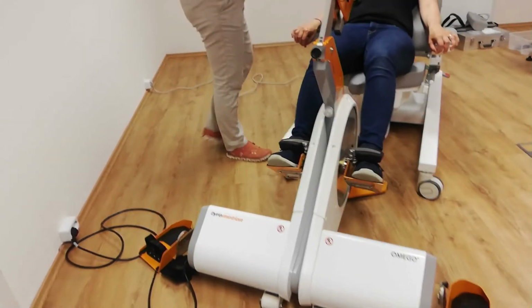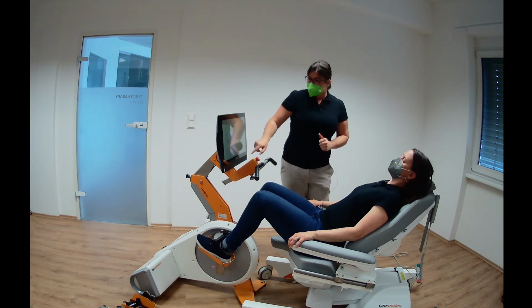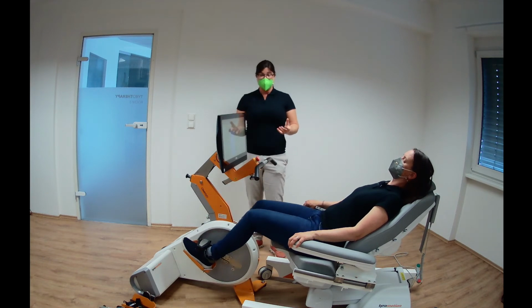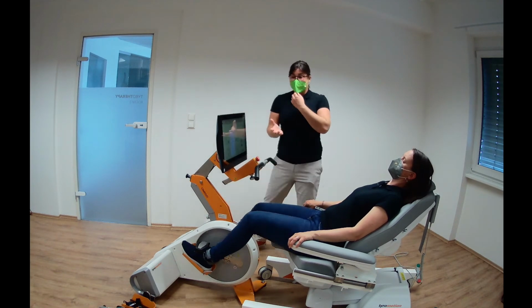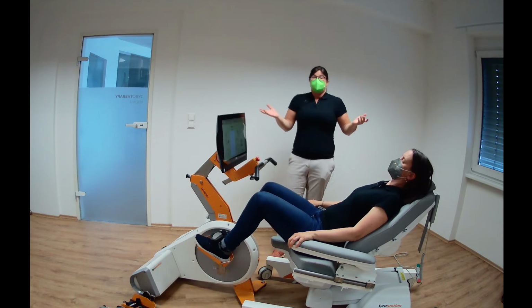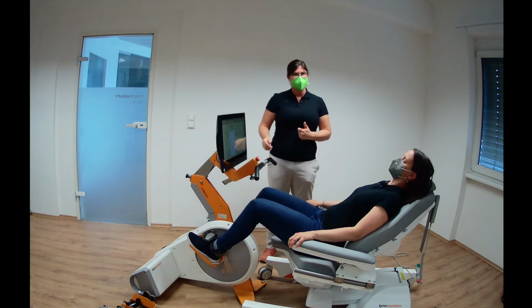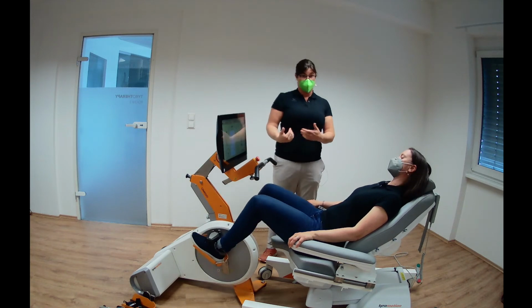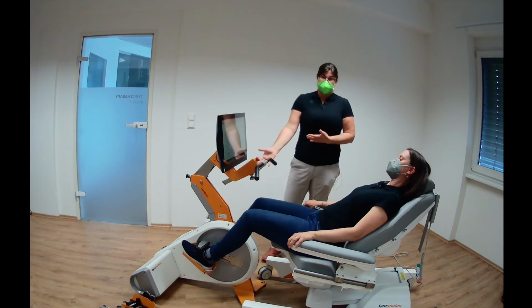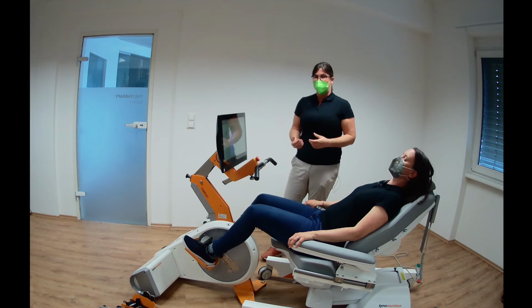All right, thank you very much. So I will make a step back again. Here you can see it again. We are in the coupled mode, so both legs together. If I ask Barbara now to press only one side, the other side will follow. So this is what we know from the gym. We can cheat in the gym a little bit, so we can use the non-affected side more than the other side. Here we can let her do the exercise like this, or we can also let her do the exercise with both legs using the same amount of force.